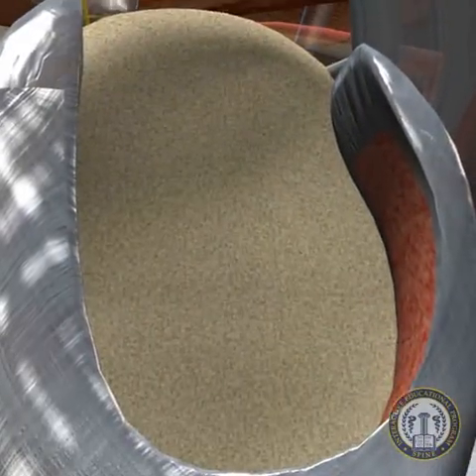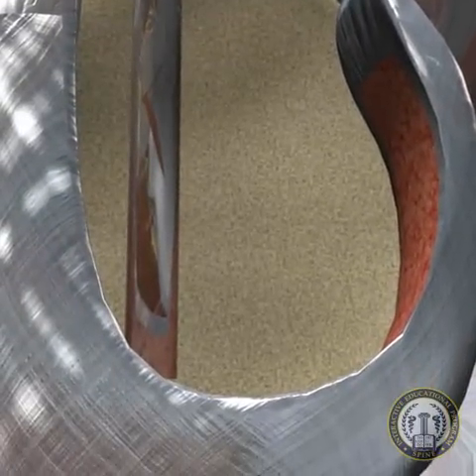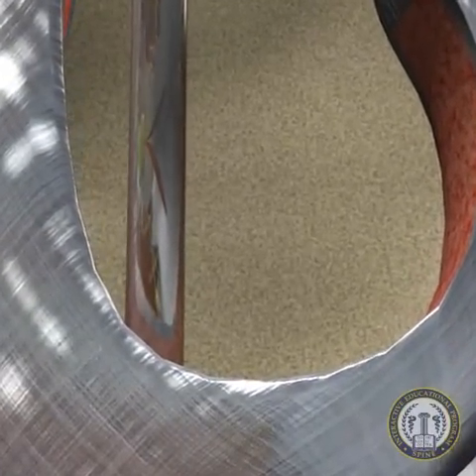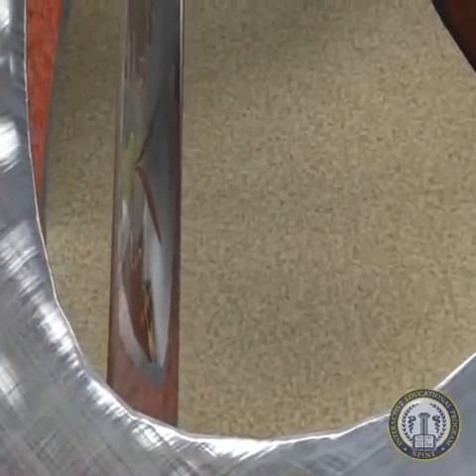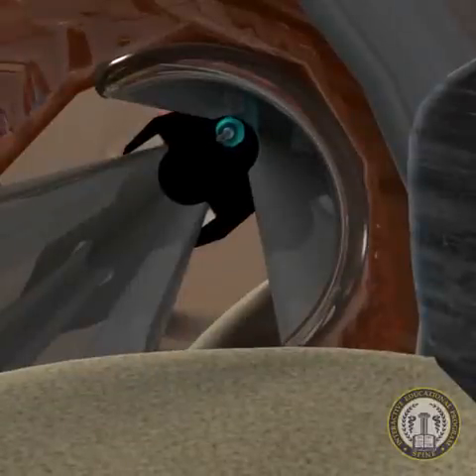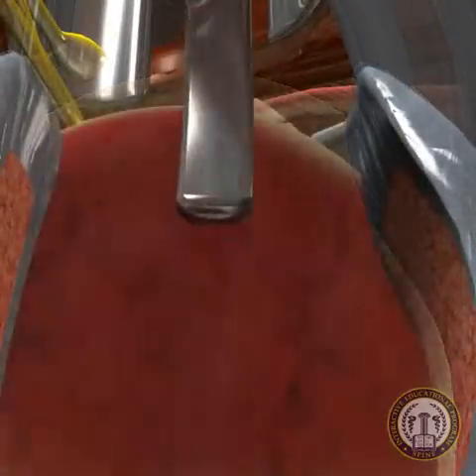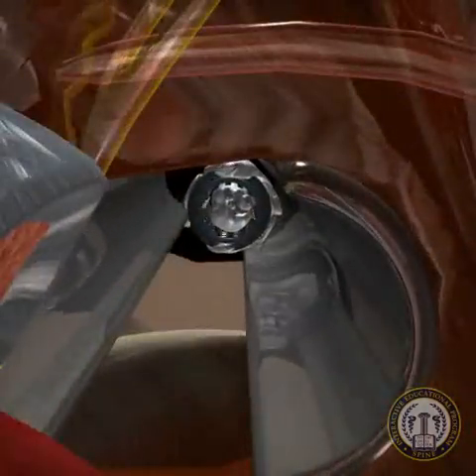A contralateral annulotomy is made with a long cob elevator under fluoroscopic guidance. This annulotomy adds to ligament release for deformity correction, but also helps allow for placement of the cage directly at the annular ring of the vertebral segments. The discectomy is completed with rasping of the end plates for punctate bony bleeding to assist in the fusion process.